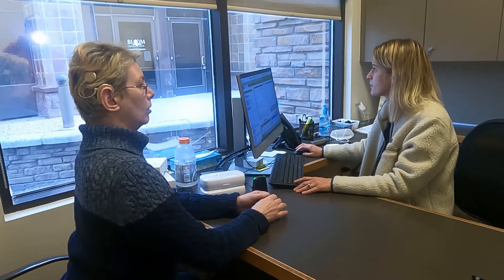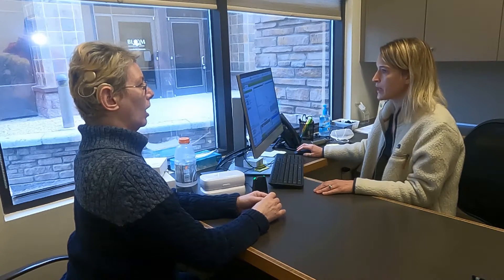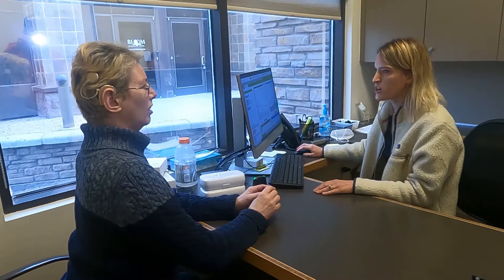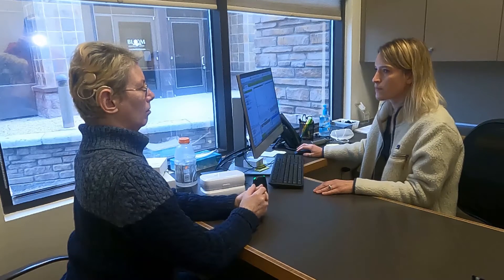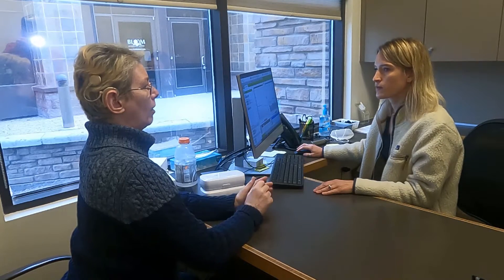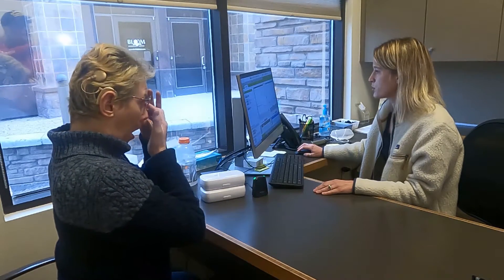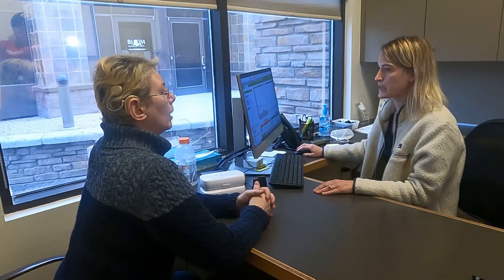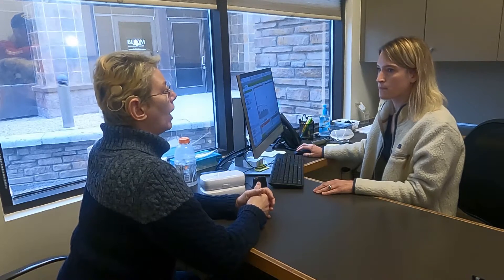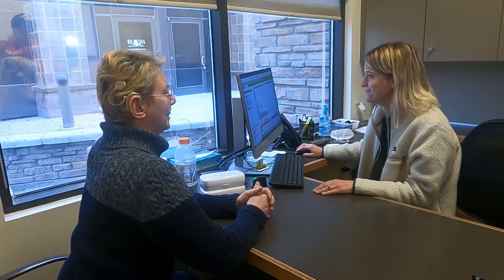I need to go down more. Let me turn the left one down — that's one click on each side. Do you think that's more comfortable, or do you want me to go down? Sounds weird. That's one click down. I'm wondering if we should go do some testing and then come back and do some programming. Does this sound better? No. Okay.